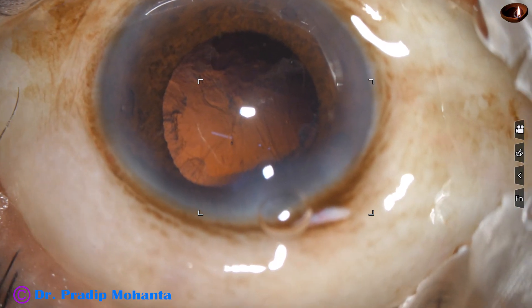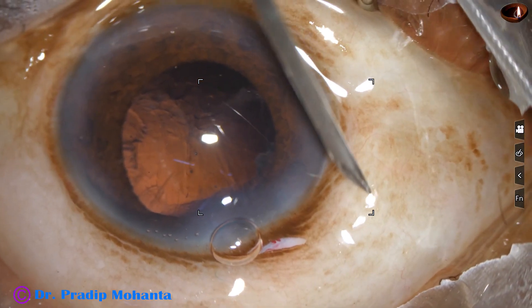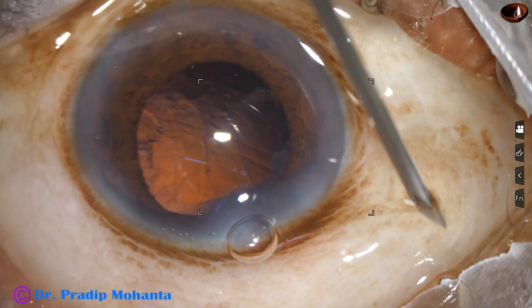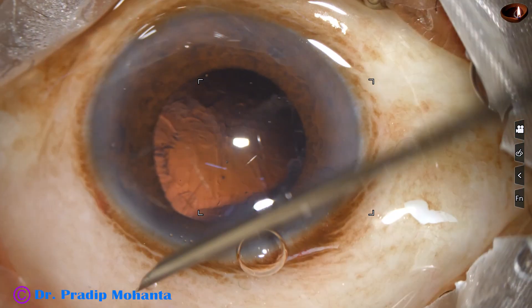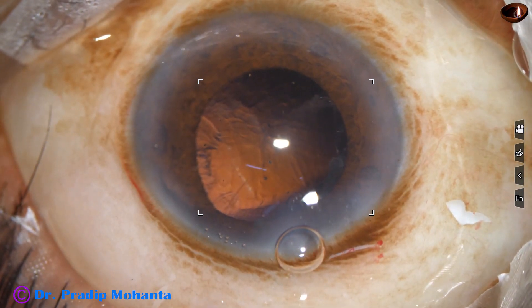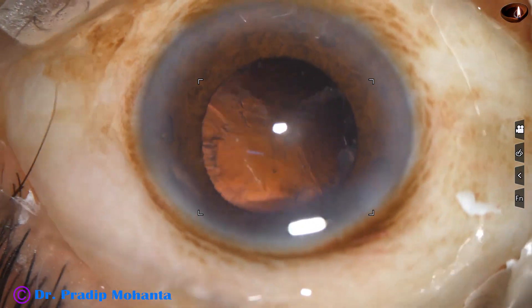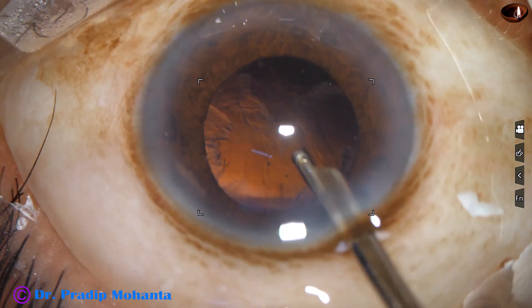The patient never complained of pain. There is chemosis of the conjunctiva, so small cuts are made at the conjunctiva. Cortical cleanup is now being done.